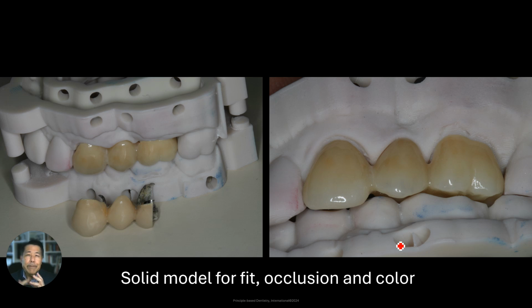But the patient just felt like maybe there was something that needed to be done more definitively. And of course, we had talked to the patient about this first. There's recurrent decay that goes up underneath an existing crown or especially a bridge abutment. And we're always concerned about, are we able to get all the decay out? In this case, the decay started up underneath the gingiva on the lingual margin, so we had lased that tissue away, gotten up underneath there, and I felt pretty confident that we had it sealed up. But the patient came back a couple months later and said, hey, everything's holding up, but I just have this feeling that maybe something's not totally sealed up. What are my possibilities? So we went through all the different restorative possibilities and chose to take off the bridge, check the abutments, and then if everything was okay, fabricate a new bridge, but one that would not have repaired margins.